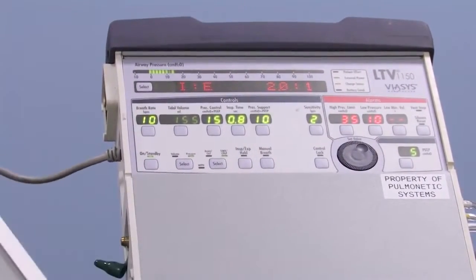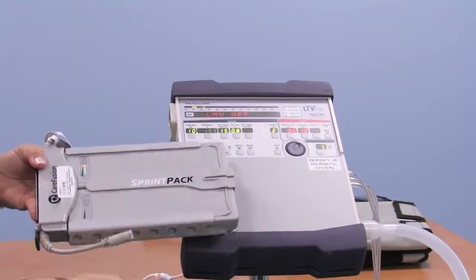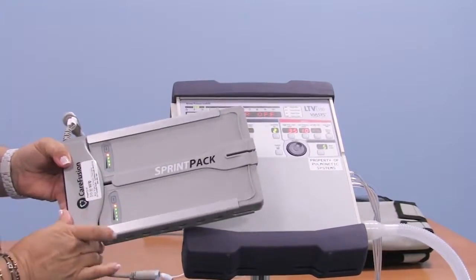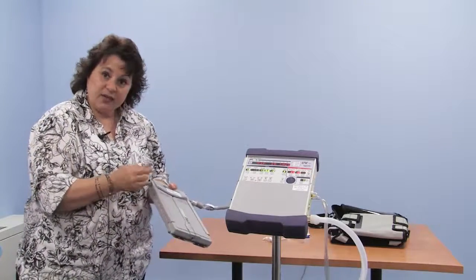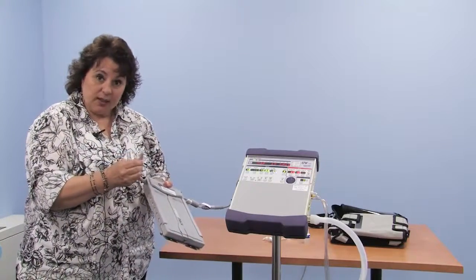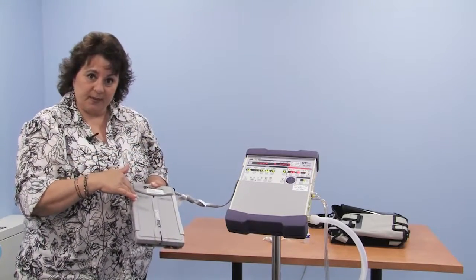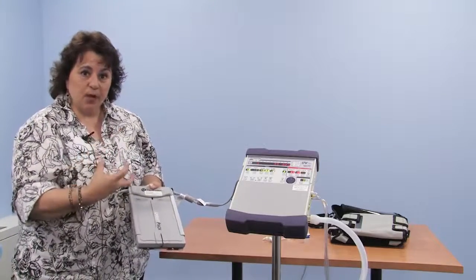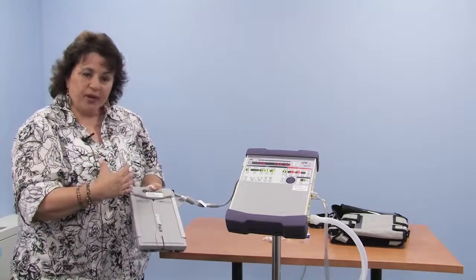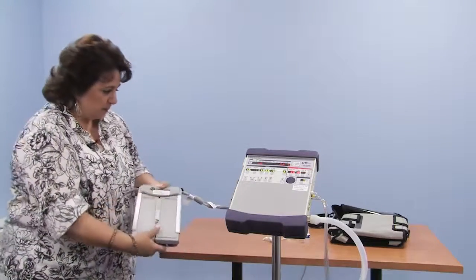So we're now running on the Sprint Pack, and we can see how much power is in the Sprint Pack each side by holding down the button. The Sprint Pack would then connect directly to the ventilator plug and would charge both, run the ventilator and charge the Sprint Pack at the same time. So it's important when you're traveling to take your ventilator plug with you so that you can charge your battery if you need to, or run your ventilator if there's any battery failure.